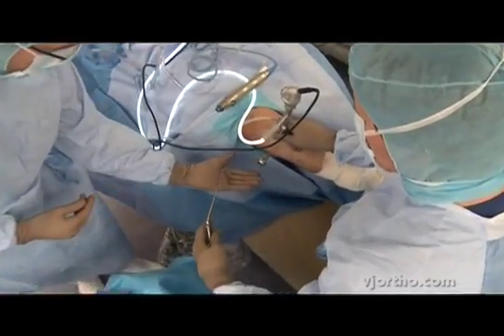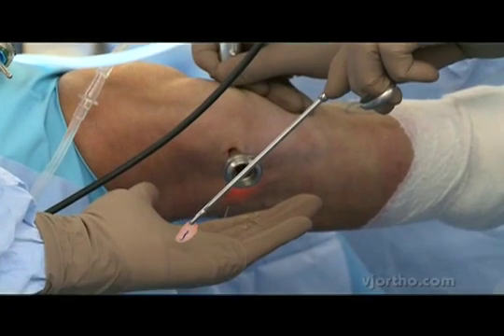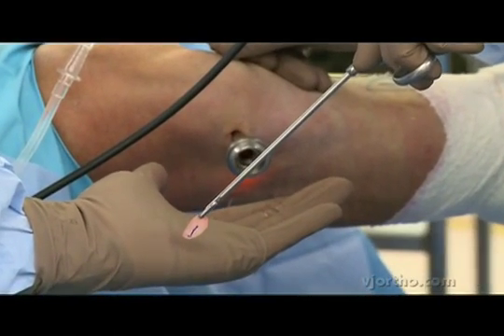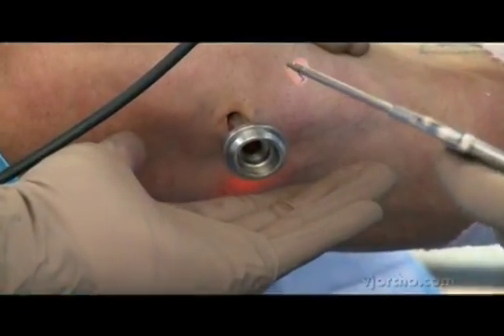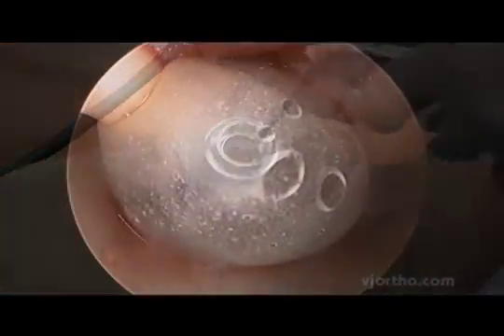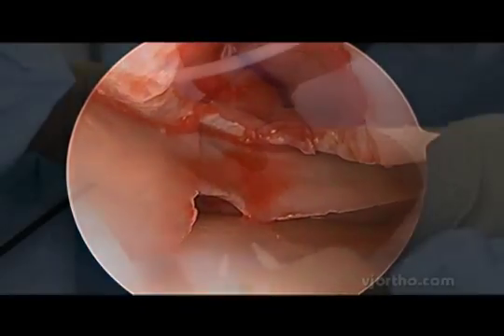The definitive graft has the cell side up, with a methylene blue marker on the smooth side which is the articular side, and we place it into the joint in the direction in which we intend to implant it. We've got adequate covering at the base of the lesion and to some extent up on the walls.